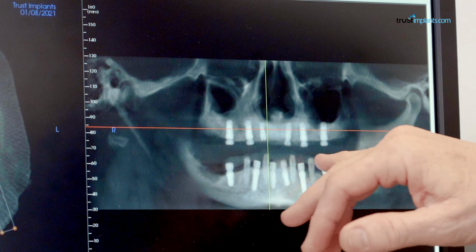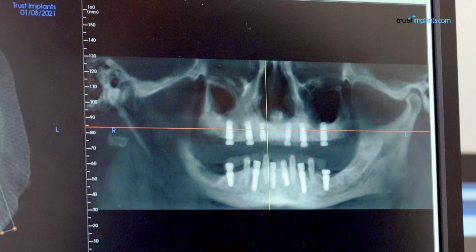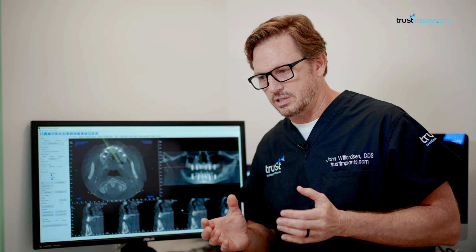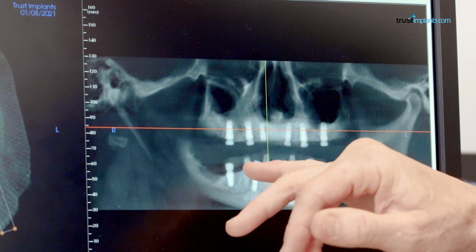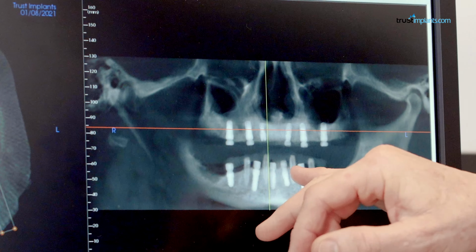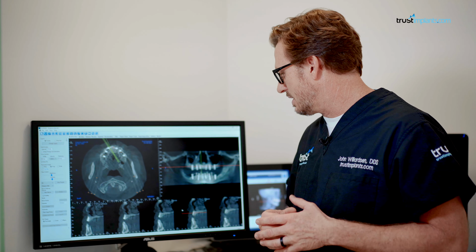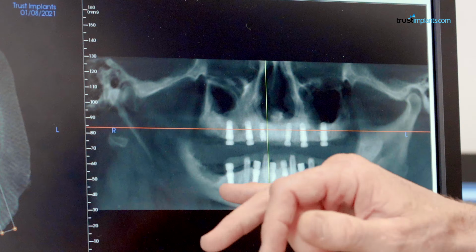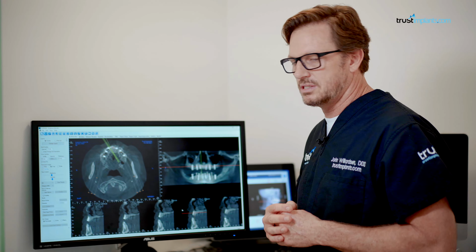And so I did leave a few natural teeth, which I used for a temporary. We want to make this process as smooth as possible for patients going through this. So by making him a temporary on some of the roots that were left behind, which I will be removing once we get to the final, I figured while I was in surgery on his case, let's just leave them and then we can make his temporaries while implants are healing. Bone grafts are healing. We had some large bone defects, so I needed some time for these to heal.